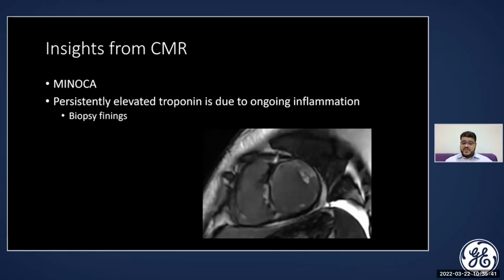The fact is that most of the time biopsies are taken from the right side of the heart going through the venous system, and they are taken from the RV side of the septum. And as you can see, there is a significant area of delayed enhancement that's already fibrosed, and probably that's why the patient did not have any evidence of inflammation.